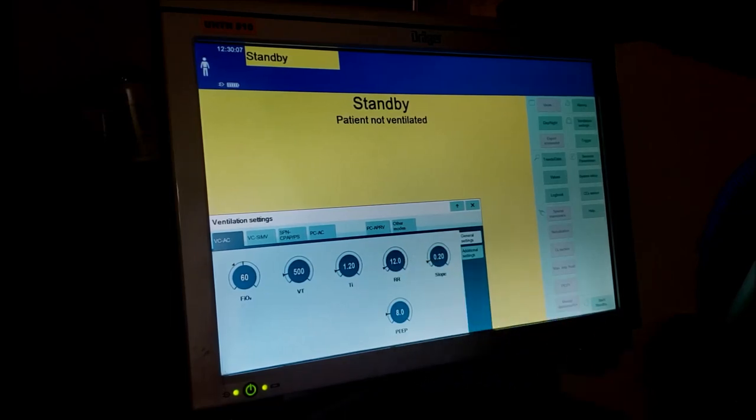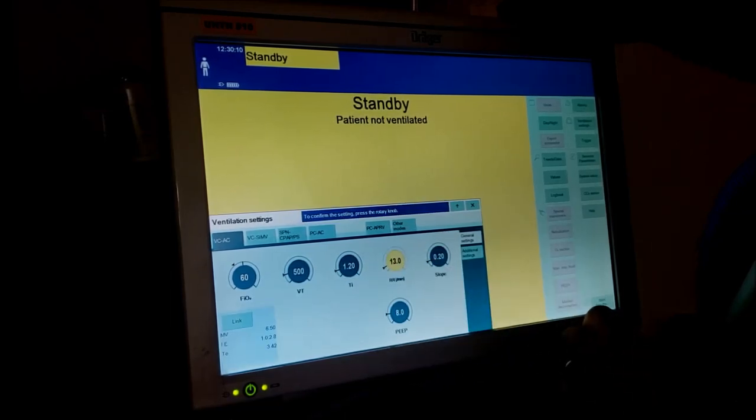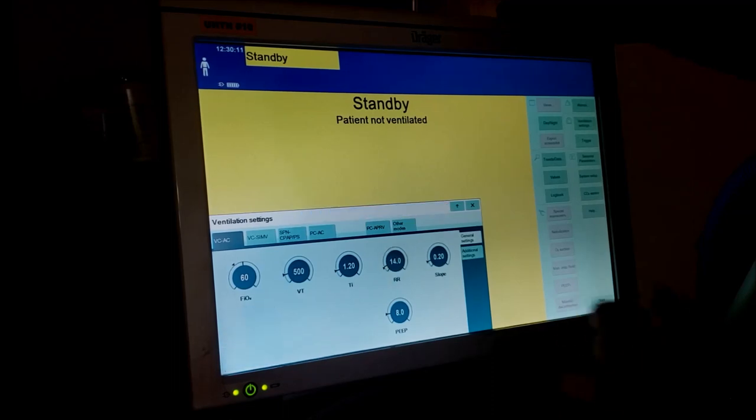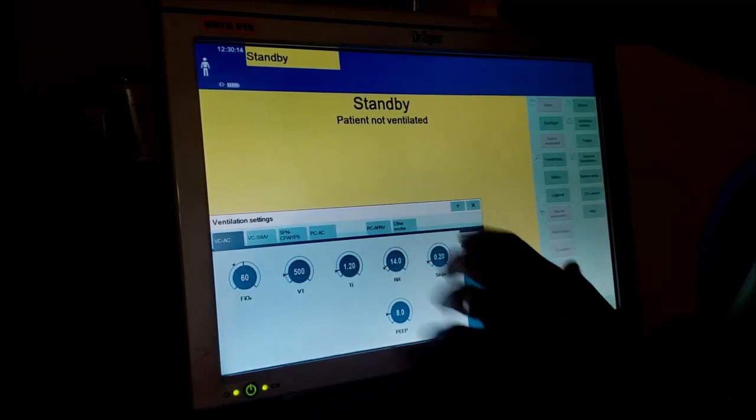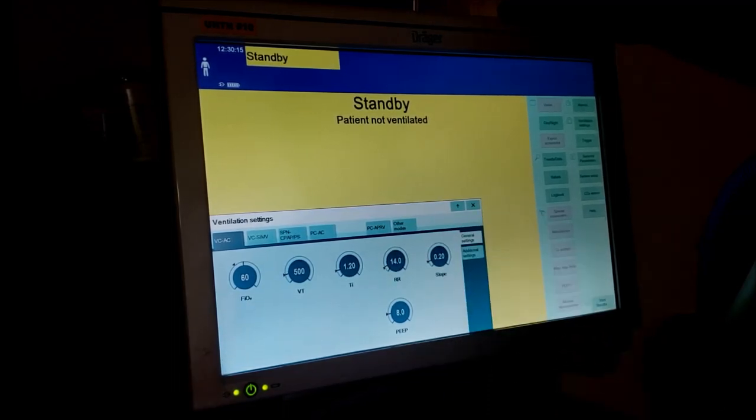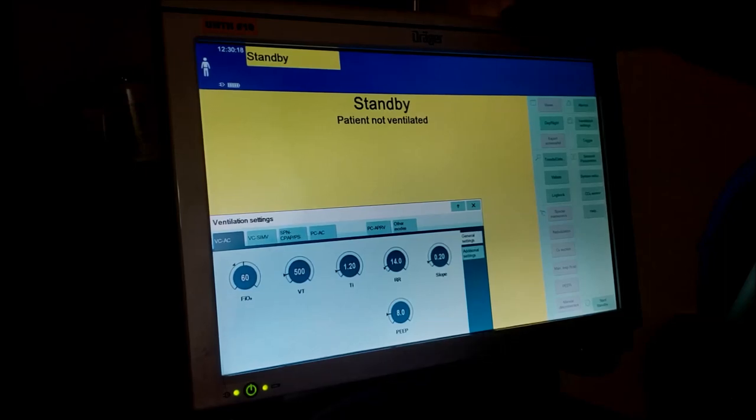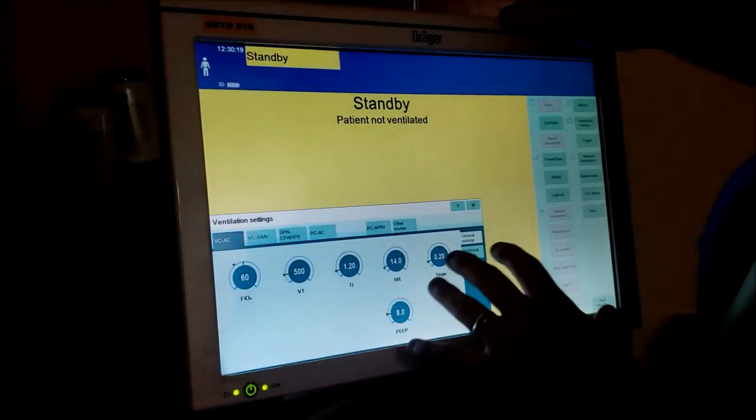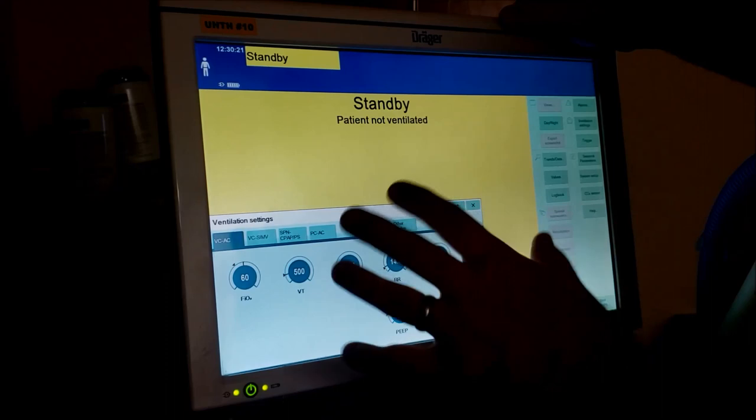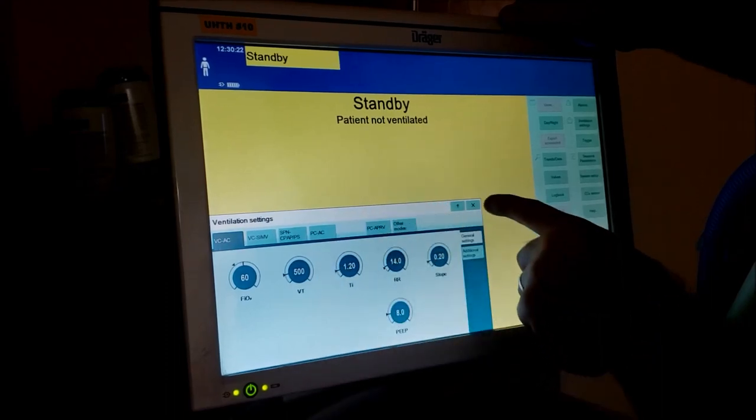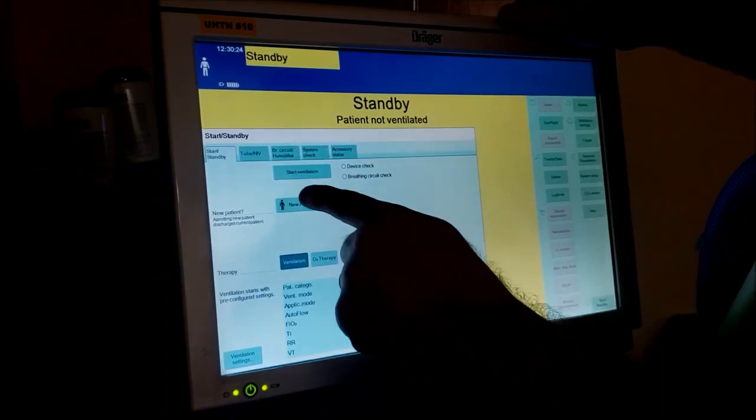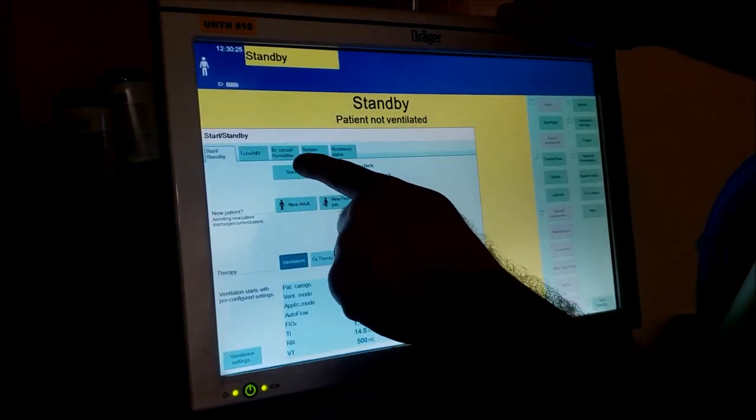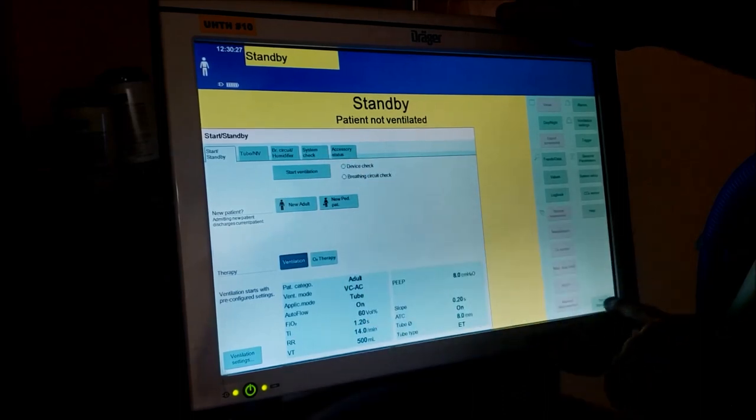Respiratory rate of 12. That's the current respiratory rate. Touch, adjust, confirm if we want to go anywhere from 12 to 20 - that's usually where we're gonna start. Don't worry about the slope. PEEP - we always start at 8 and we adjust that for oxygenation. All of this looks good. I'm gonna X this out just like a Windows screen. X that out there and let's go to start ventilation.